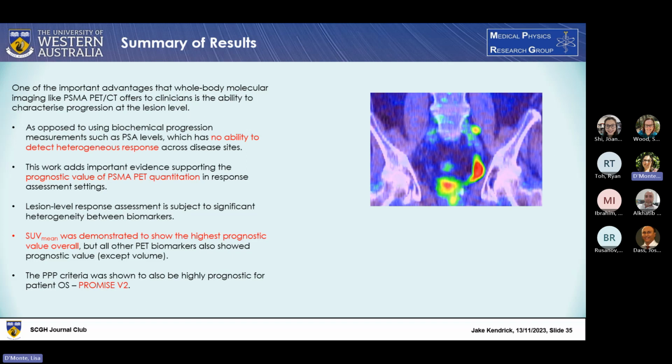We'd also like to implement AI-based methodologies into this. We analysed purely the nuclear medicine physician delineations in this study. The reason we did that was because of the difficulty in determining which lesion at baseline was matched with which at follow-up based on AI delineations. It would either require us to manually go through each lesion and match it up to a follow-up scan, or implement some registration techniques and do that classification automatically, which definitely can be done, and we're looking at that.